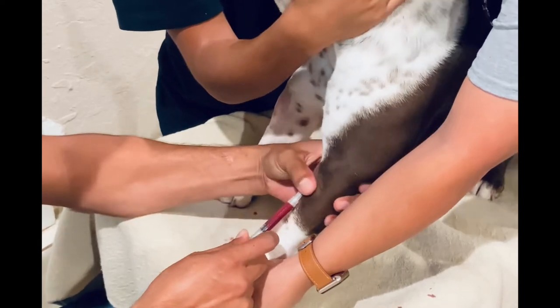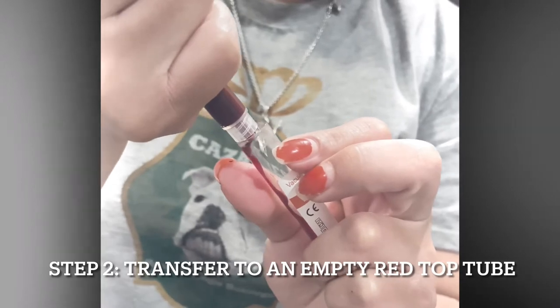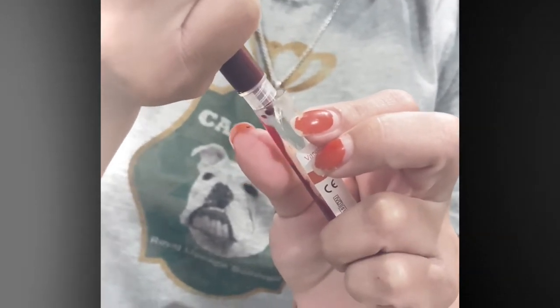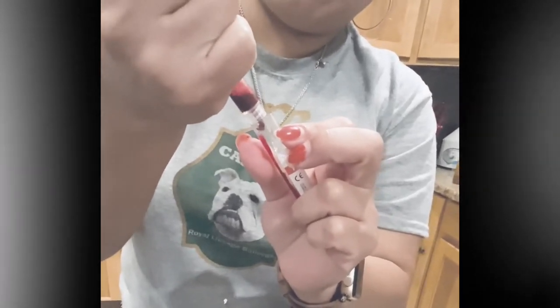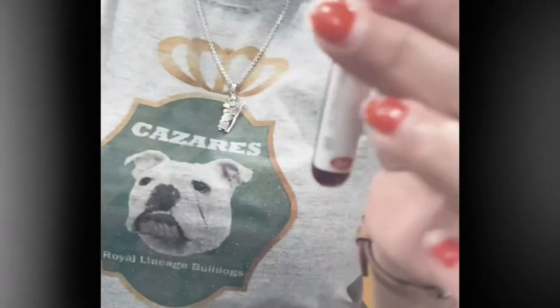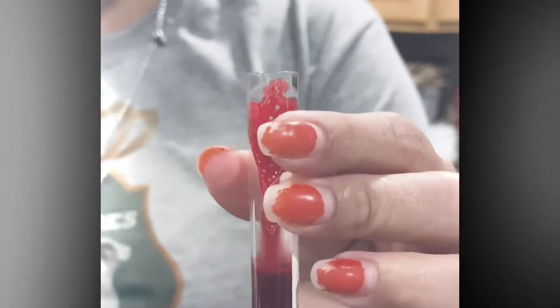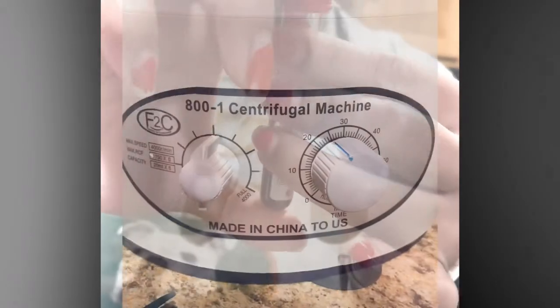Then you're going to want to transfer it to a red top empty tube. Do it on the side carefully to avoid breaking any red cells. If you don't have a centrifuge, you can just leave it standing for two to three hours until it separates the blood from the serum.